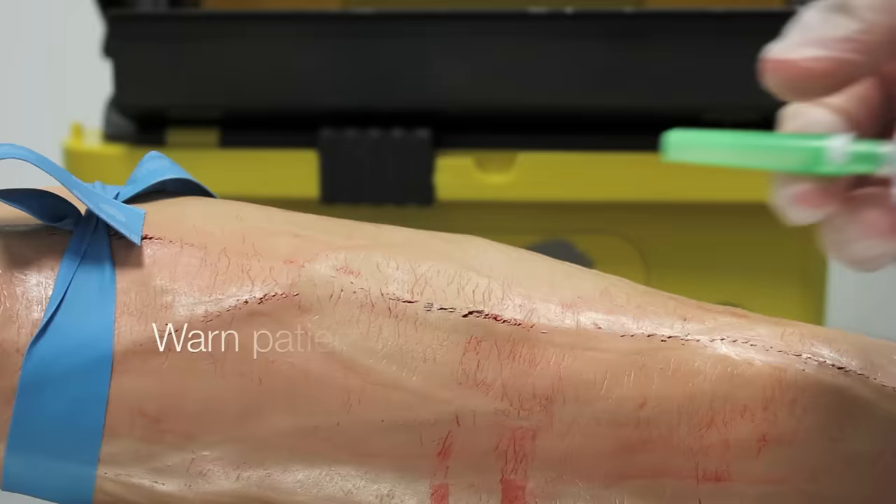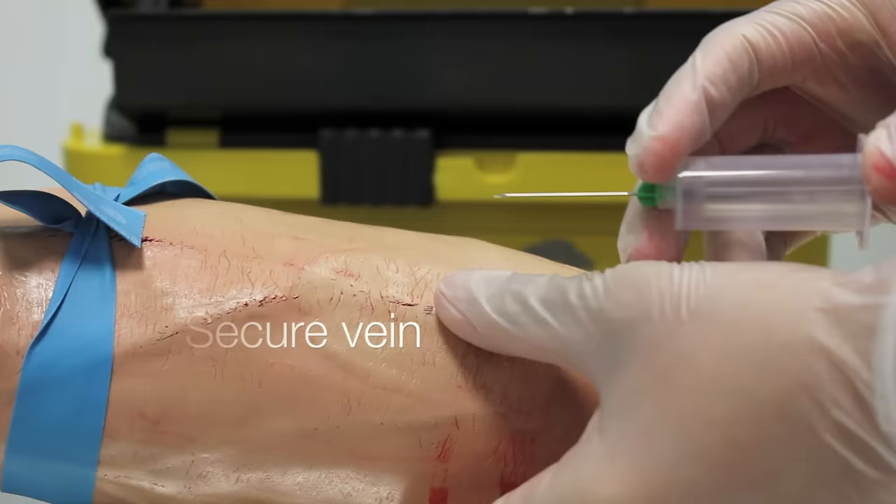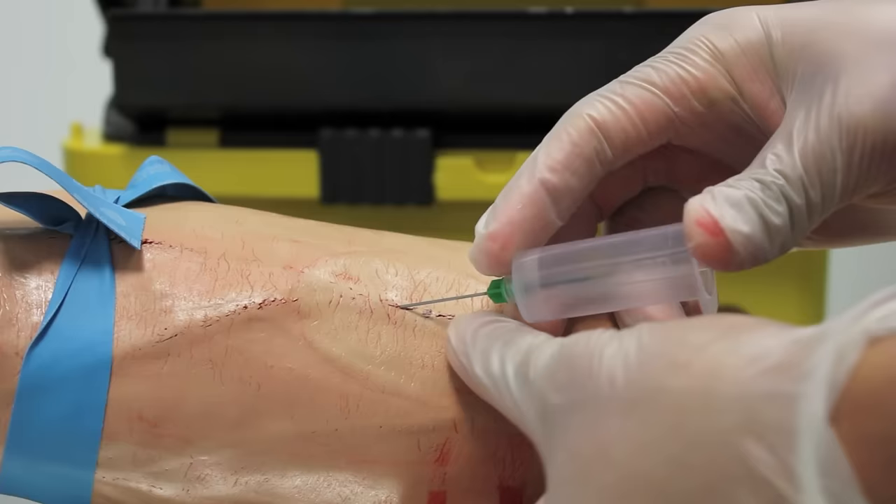I'm now going to insert the needle into the vein — is that okay? It should feel like a sharp scratch. First, take the sheath off the needle. Make sure the bevel is pointing upwards. Secure the vein that you want to take the blood from. Insert the needle at 20 to 40 degrees in the direction of the vein — you should feel a slight give as it goes into the vein.